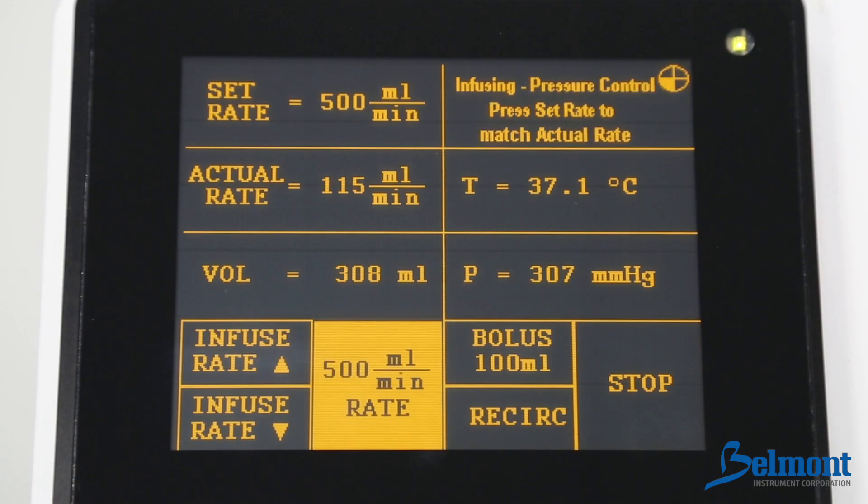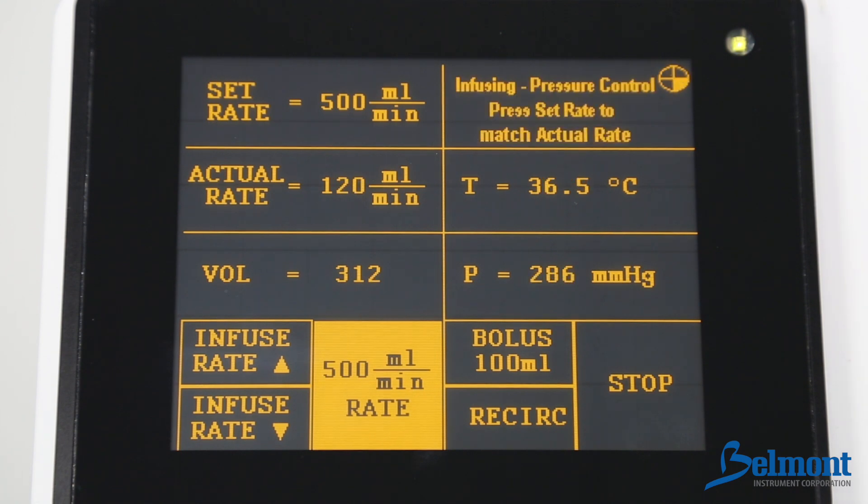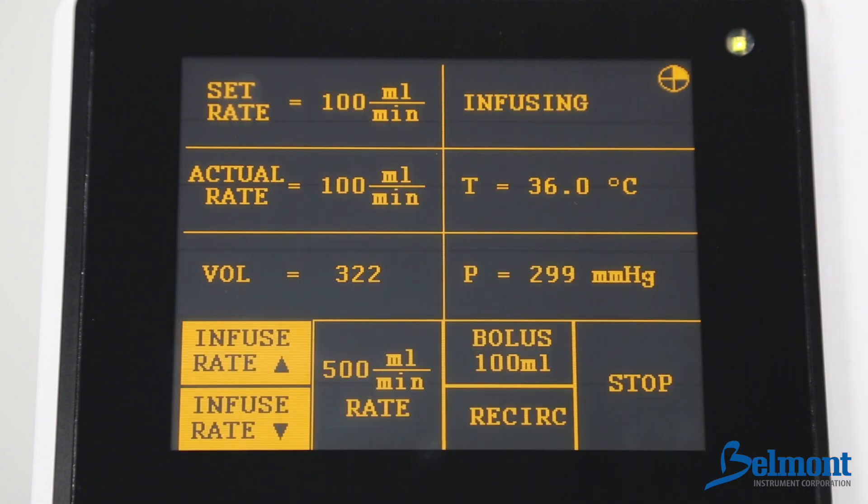Pressure control displays when the set rate is higher than the maximum allowable infusion rate. Infusion will continue during the pressure control alert but will be automatically regulated within safe limits. To silence the alarm, press the set rate to match the actual rate.